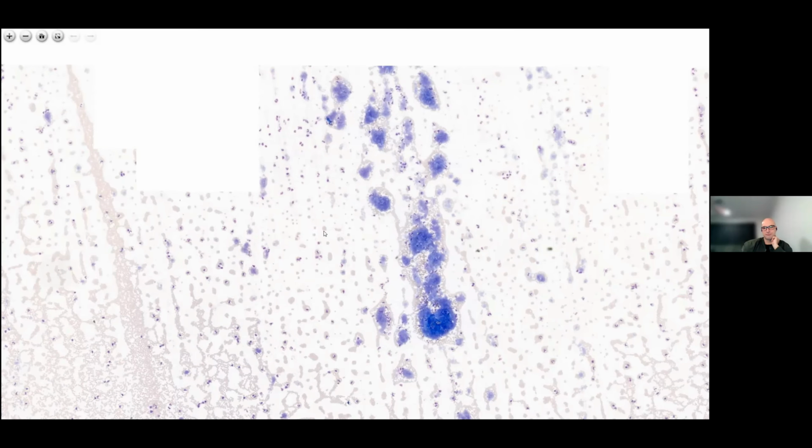There is some evidence that there could be a difference between optical and impedance analyzers, and whether they're better. But it's a real challenge. I think you're looking at morphology to see whether the platelets are actually there or not, and you have to put your hands up and say, well, we can't give an accurate platelet count.